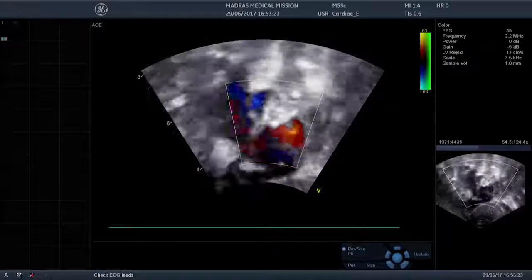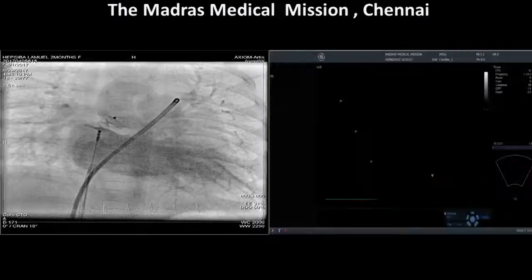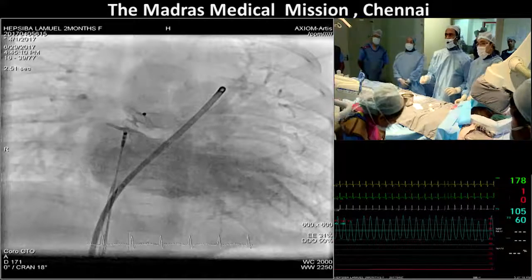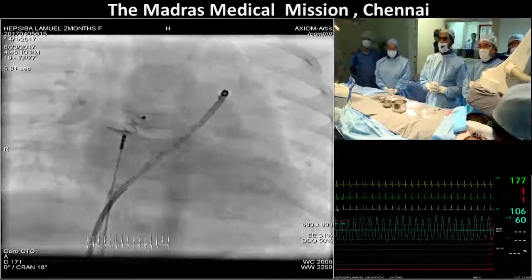Is there a possibility that the right lower pulmonary vein is being interfered with by the device? Can you show us the levo phase again of that injection? Show that injection again. Pulmonary artery side is perfect.